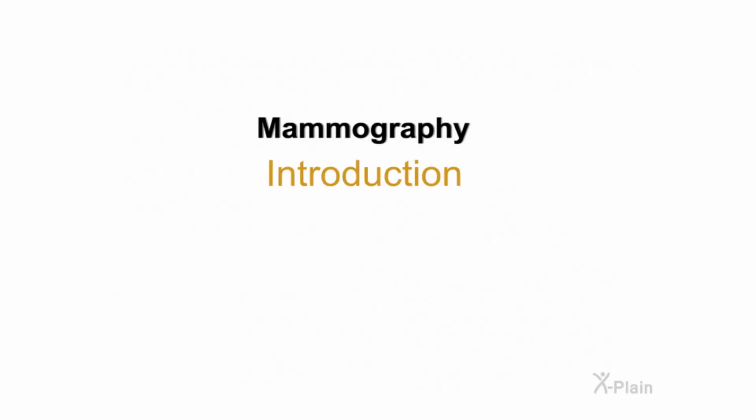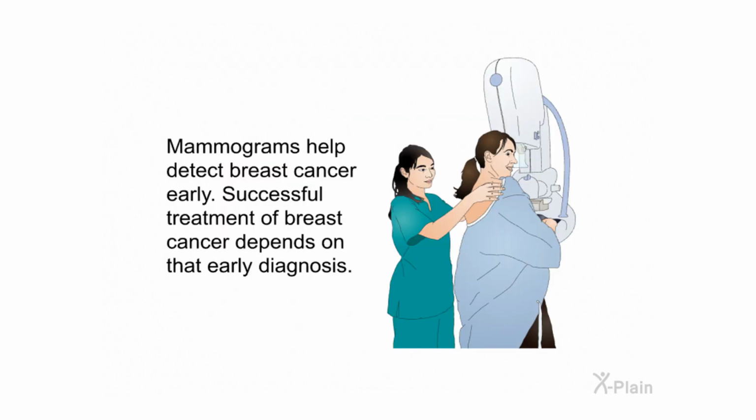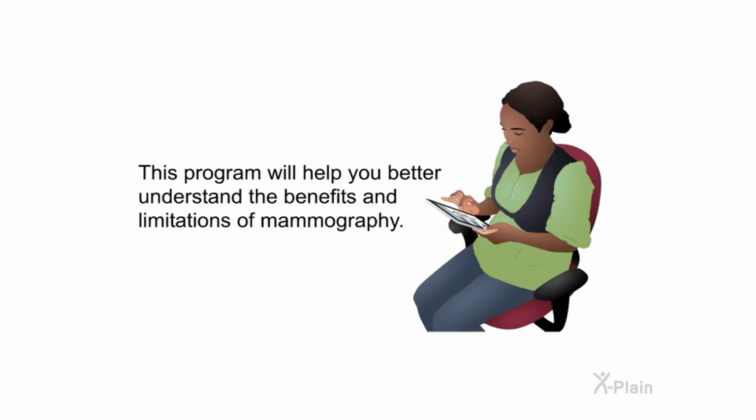Mammography. Introduction. Mammography is a test that allows the doctor to look at images of the inside of the breasts. Mammograms help detect breast cancer early. Successful treatment of breast cancer depends on that early diagnosis. This program will help you better understand the benefits and limitations of mammography.